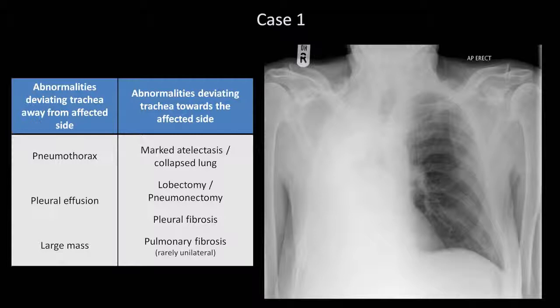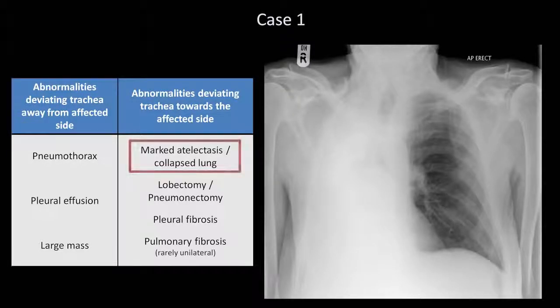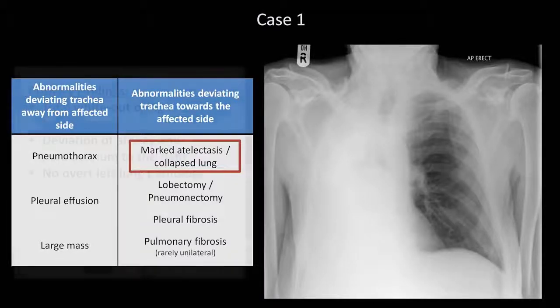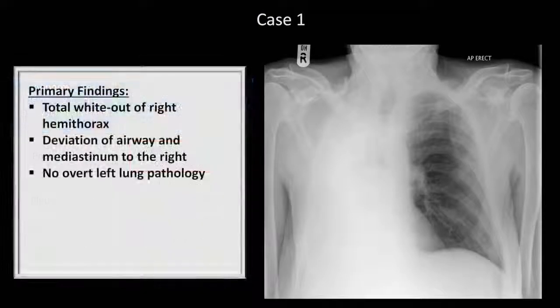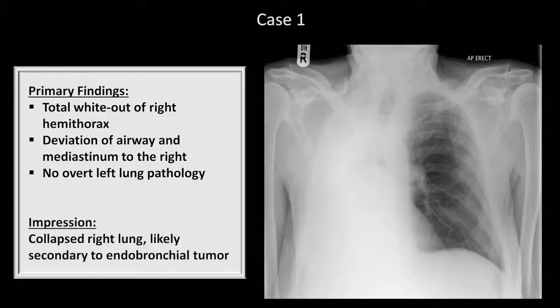Since there is no history of prior lung surgery, and neither pleural nor pulmonary fibrosis would cause a lung whiteout, right lung collapse is really the only possibility. Why would someone develop a complete lung collapse? In the setting of a smoker presenting with a subacute history of hemoptysis, the most likely explanation is an endobronchial lung cancer.